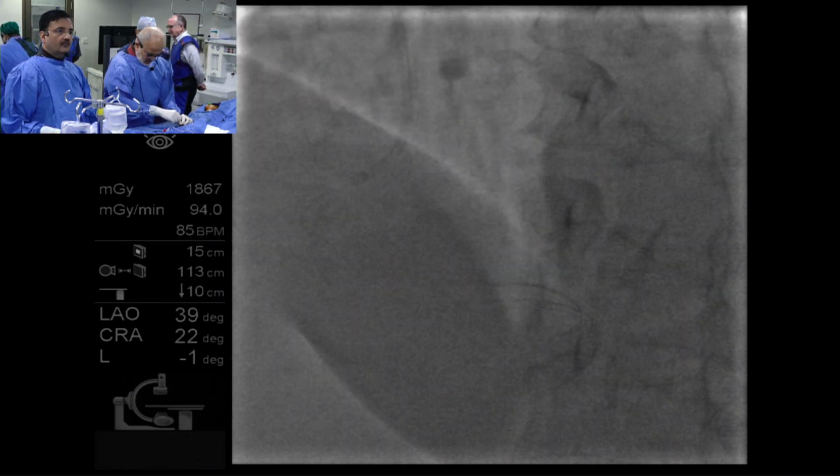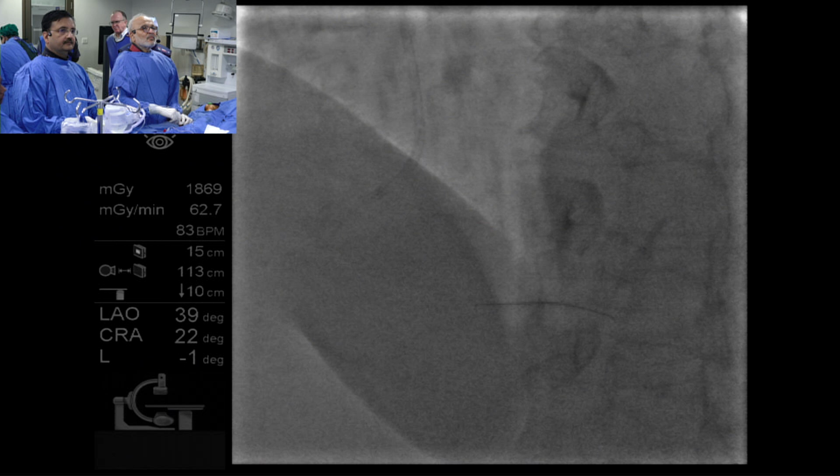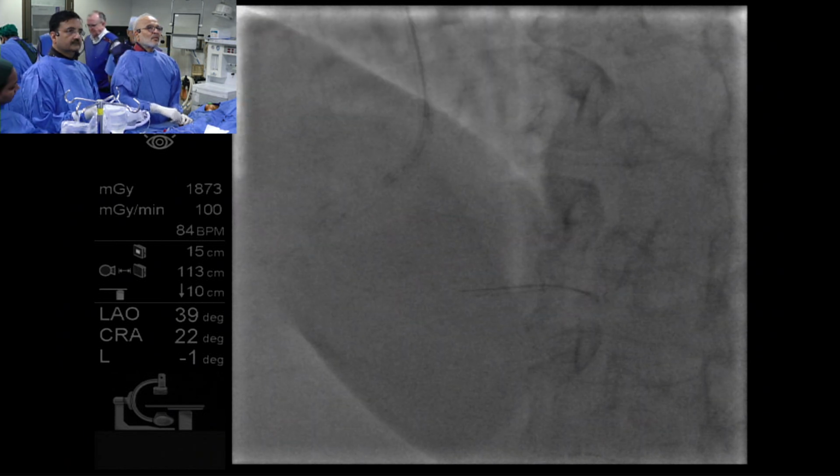Yeah, no, I agree with you. I think we saw enough cracks that we think this lesion should respond. So I agree with you.